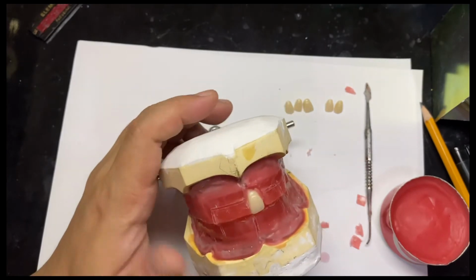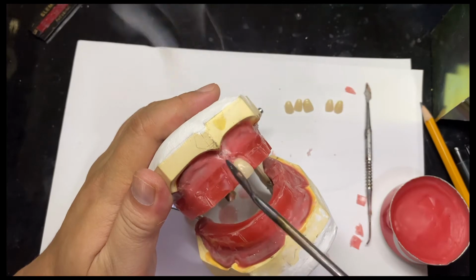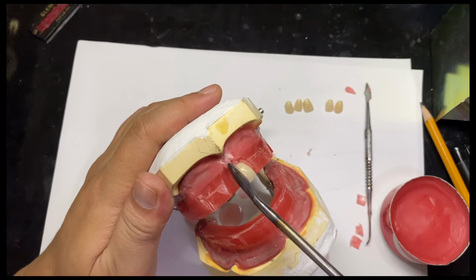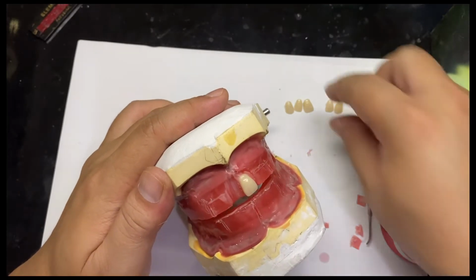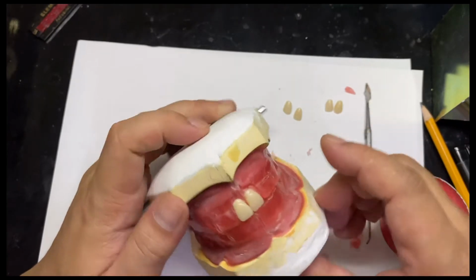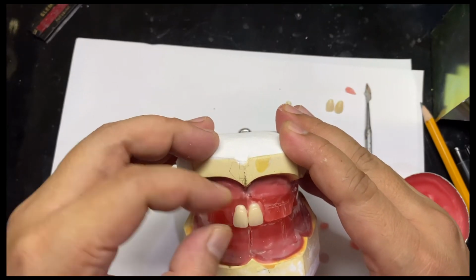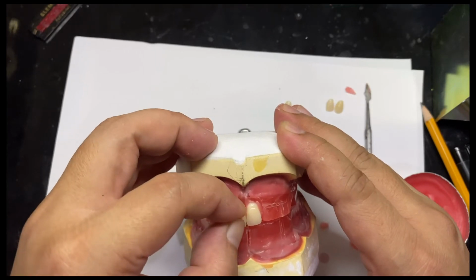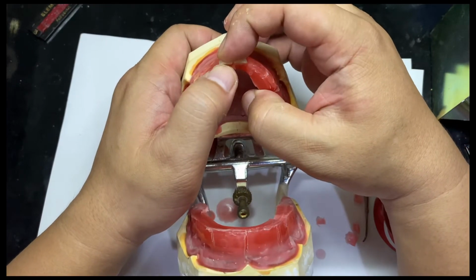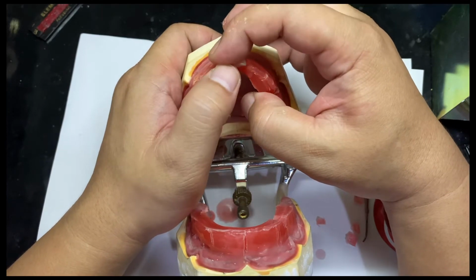Now I'm going to set another central incisor so that I'll be able to maintain the midline and of course maintain the labial contour. And then try to view it from the incisal view. It has to be symmetrical.